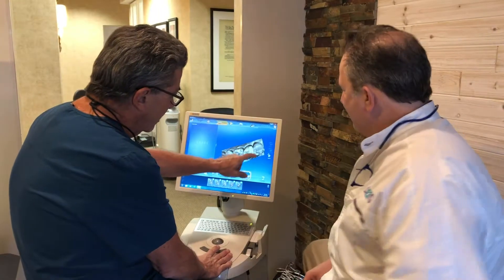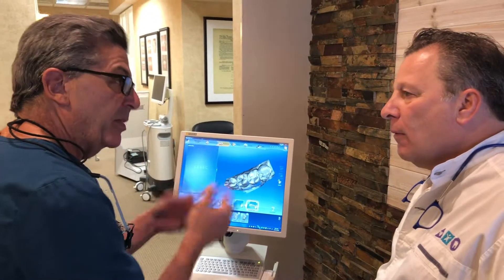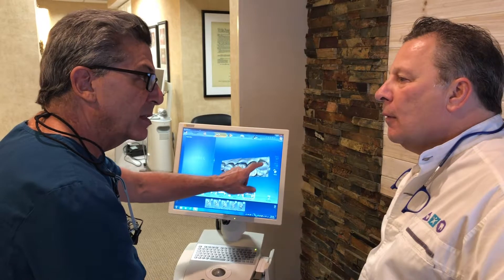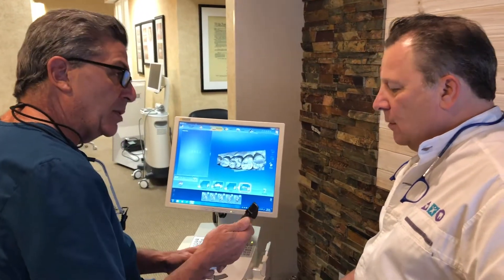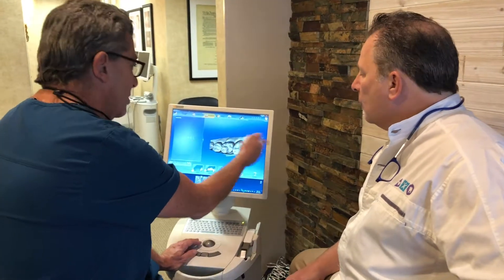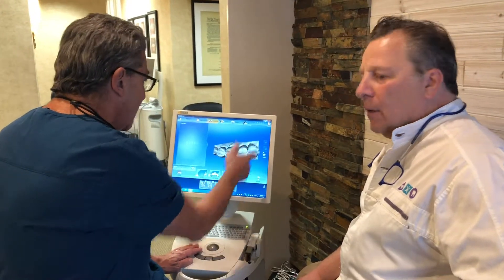She had a failing crown on this back tooth here. She had decay where the crown and the tooth meet. But the crown actually had a nice fit and a nice bite. So what I did is I'm actually making a copy of her existing crown. I took an image of her crown before I even started. We use something like a laser — it takes a 3D photo using light. We just scan her pre-existing condition, and if the tooth is in decent shape with just a little problem around the margin of the crown, we can use the basic anatomy to copy that.